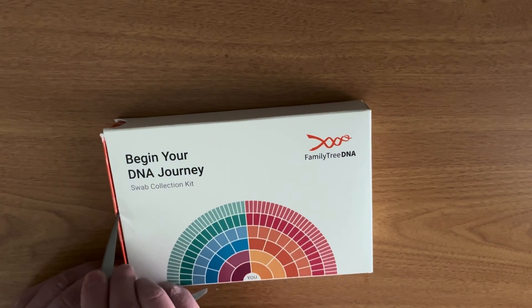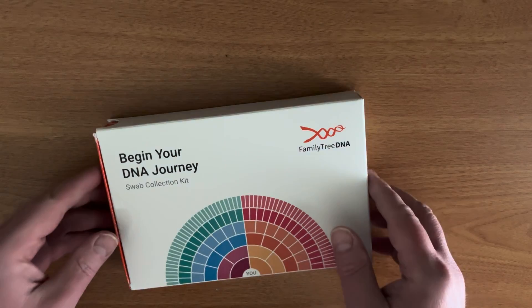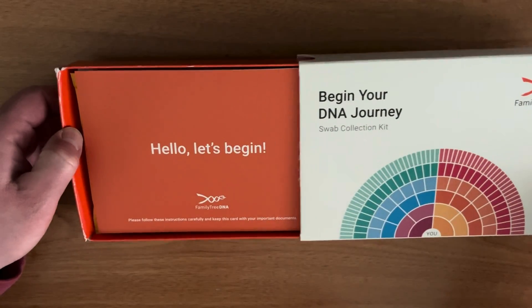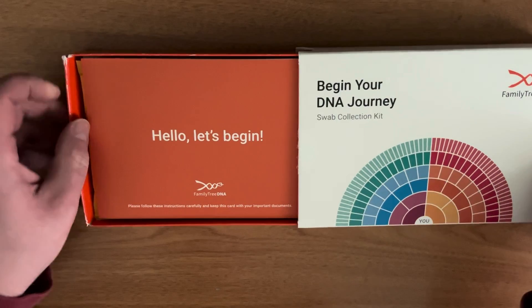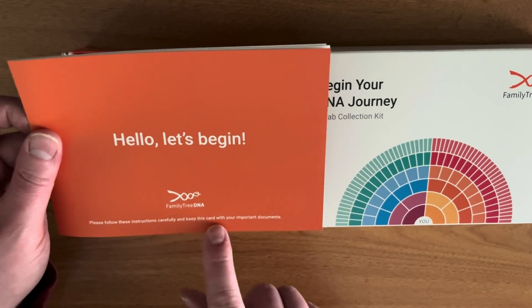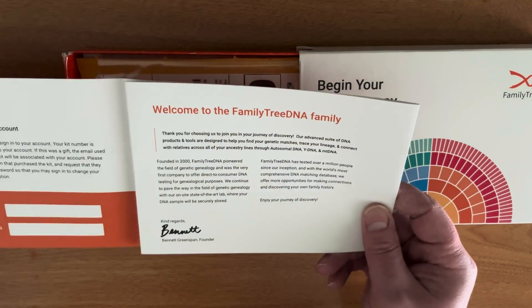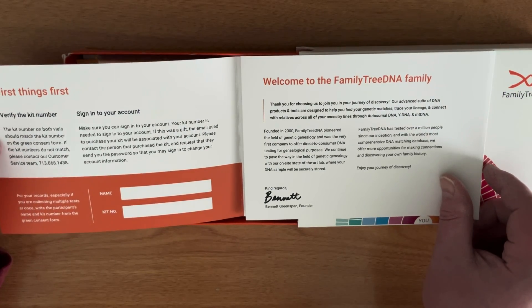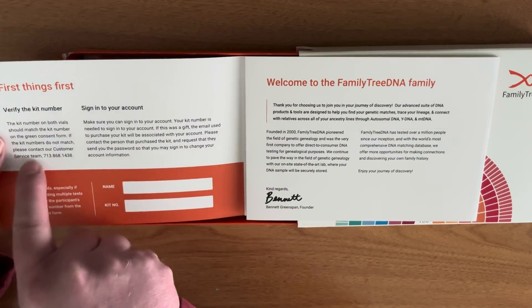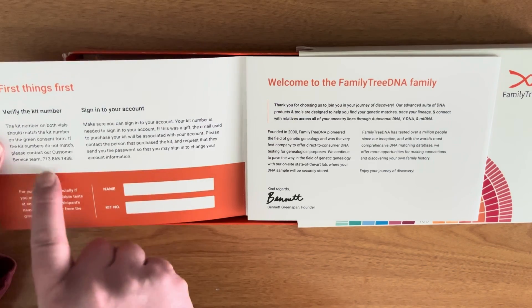Break the seal and let's see what we've got inside. The ancestry testing process is really straightforward. The first thing is verify the kit number — they're going to ask about the two vials, and each kit collects two biological samples per person, so they need to match.